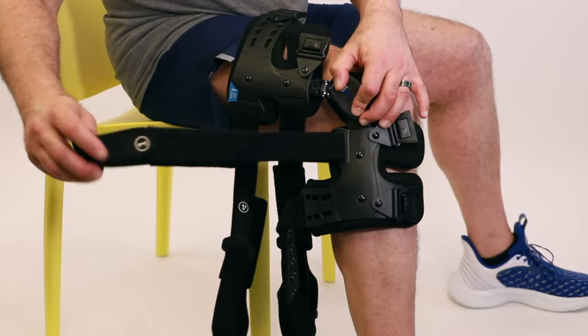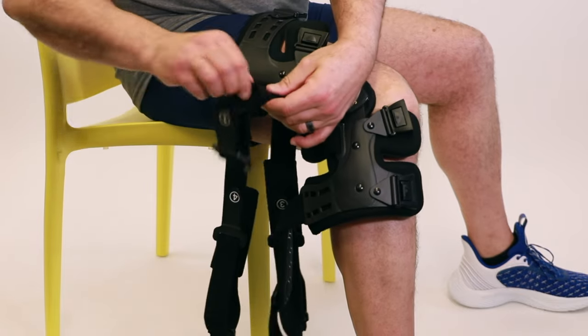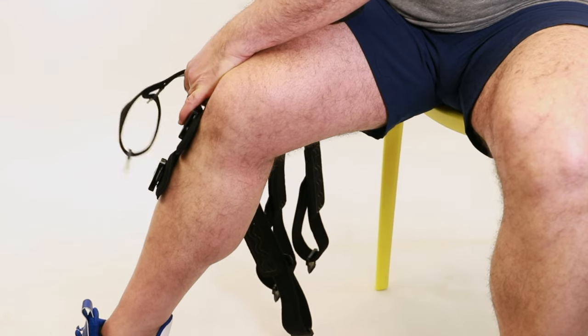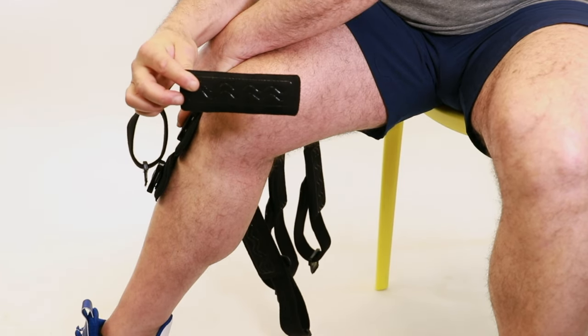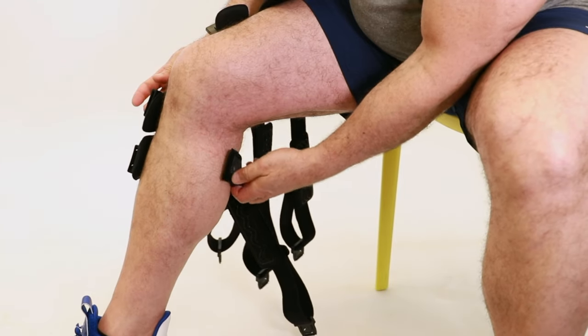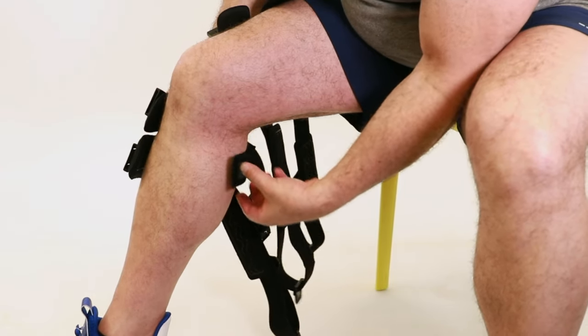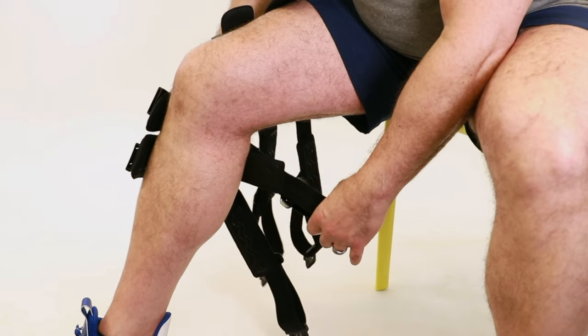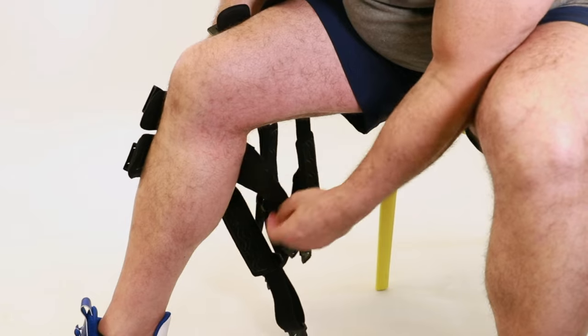Locate the number one strap and unfasten the velcro. Remove the anti-migration pad from the inside of the strap and position it on the back of the leg above the calf. Wrap the strap around the leg, making sure it is above the calf muscle, and velcro the pad onto the strap.